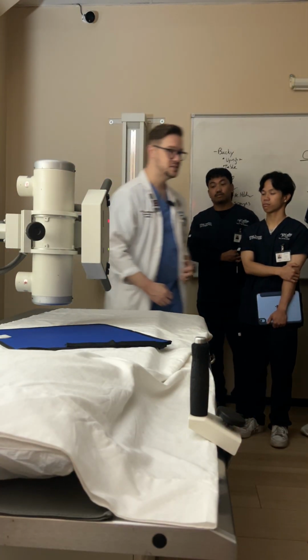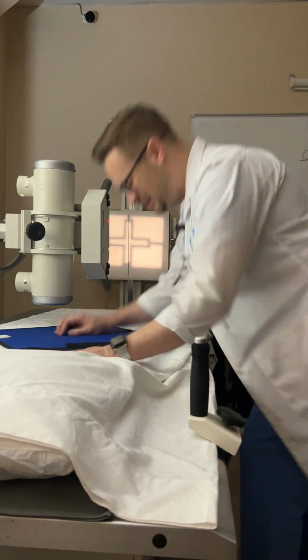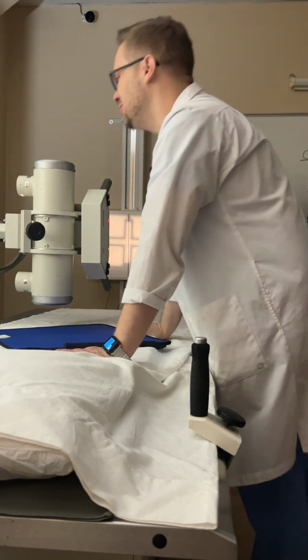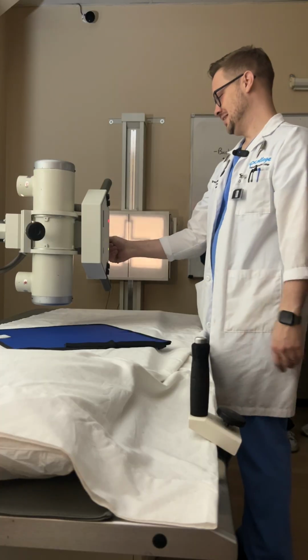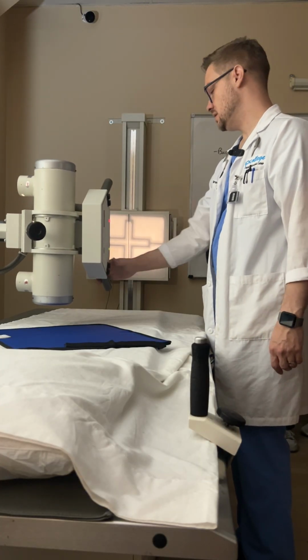What is your CR centering for a PA chest? Just so good. It makes me so happy. All right, so we're going to center to our bucky here.